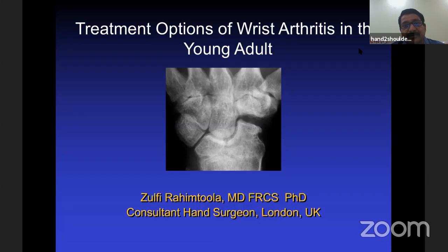What's your criteria for diagnosing AVN? If they're late, 8 or 9 months down the line, you can see it on X-ray. But definitely, if it is a proximal pole, at 3 months, 6 months, we can see AVN on MRI, but not before that. And one of our musculoskeletal colleagues does enhanced scans, gadolinium scans, in which he can talk more about avascularity. Yeah, I was coming to the point that MRI doesn't always pick up AVN in the right sense. What looks like AVN is actually not AVN in most MRIs. So there are enough controversies about using MRI as a guide for AVN.